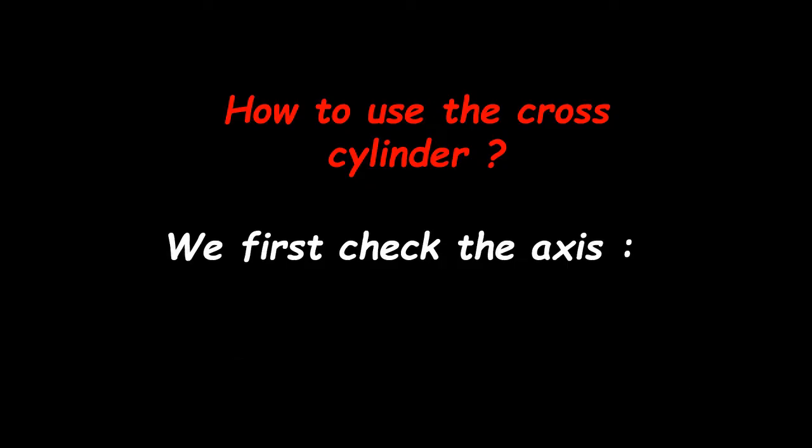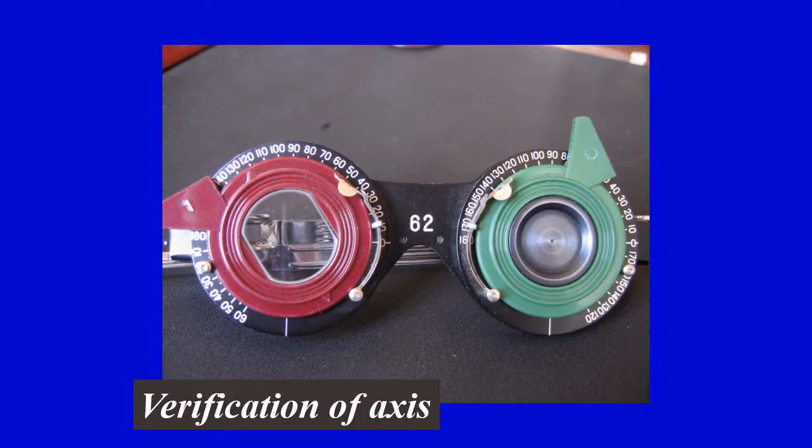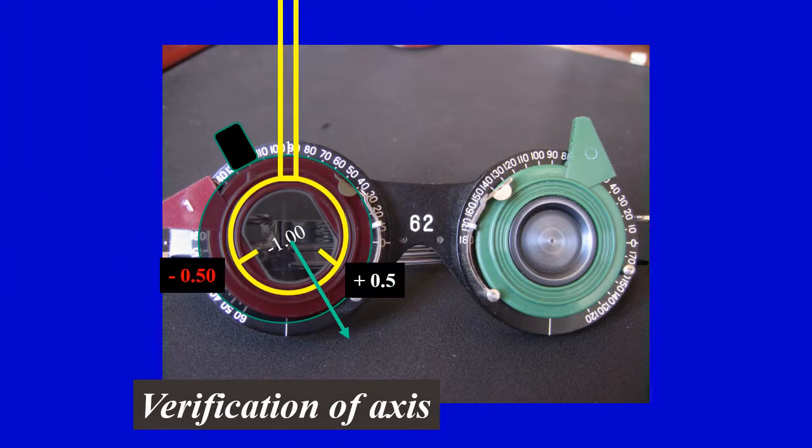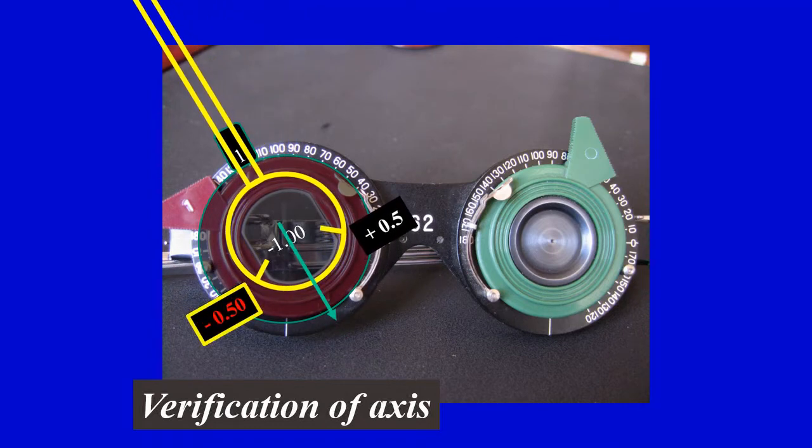On using the cross cylinder, first we check the axis. Supposing this is an example with a patient, we are checking that he has a cylinder of power -1 in this eye, and the second eye is closed. This is the cylinder in the trial frame, and this is the axis. We start by checking the axis of the cylinder. We apply the cross cylinder in such a way that the handle is in line with the axis of the cylinder tested.